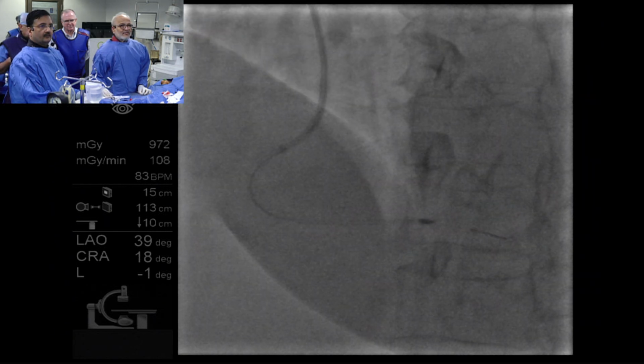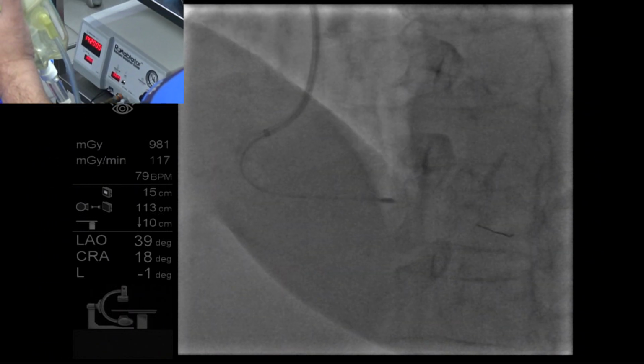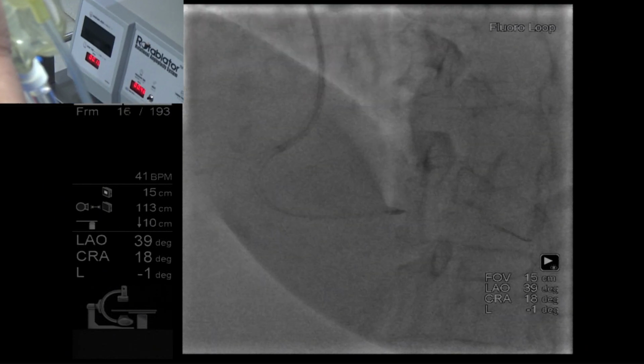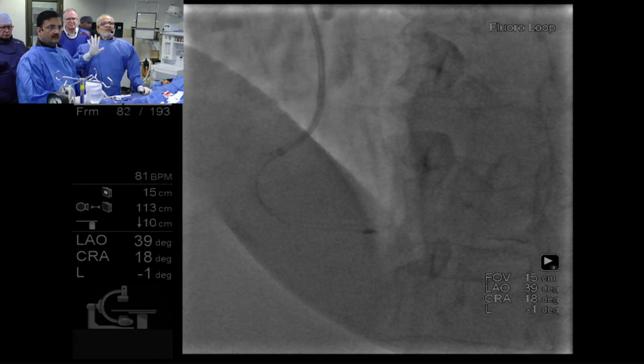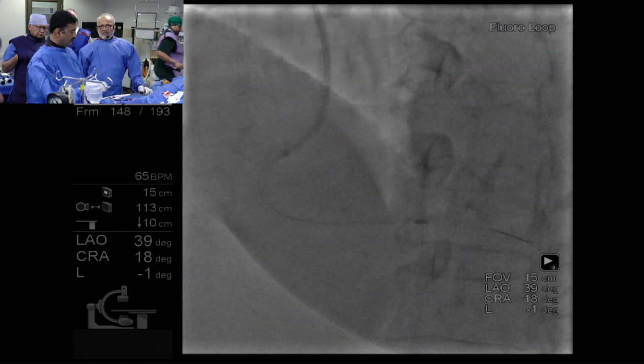Yeah, this is tough. You can see. This is tough. So, that is bradycardia. We will wait. Somebody should be there with adrenaline, atropine. Everything is fine. Just wait. But increase the speed. 160.